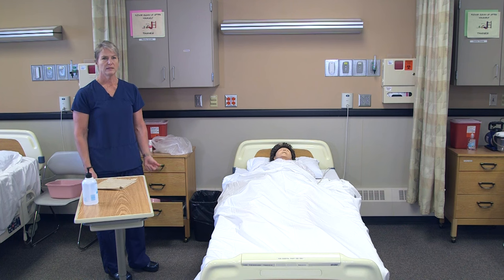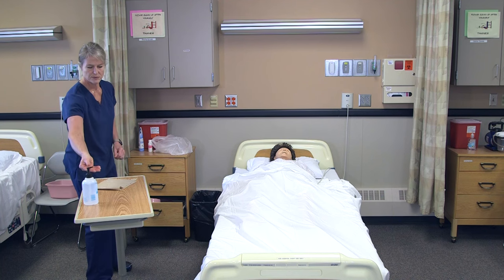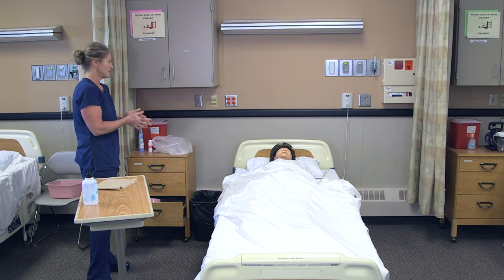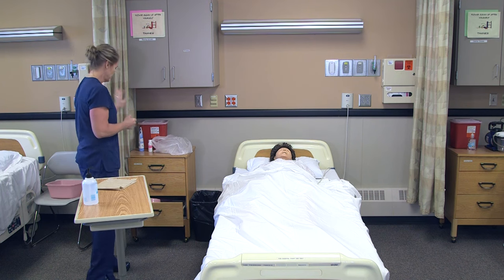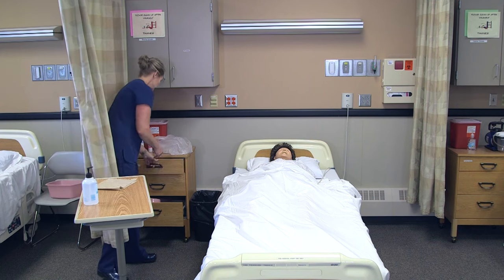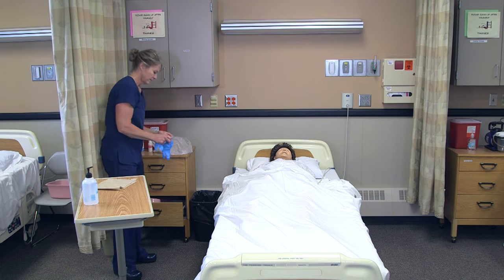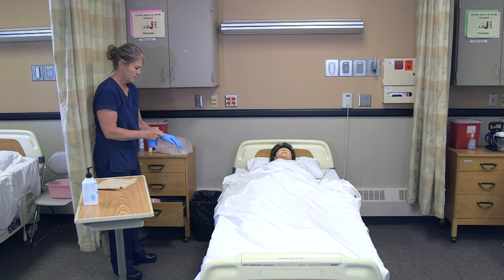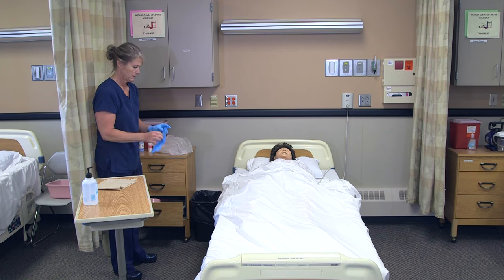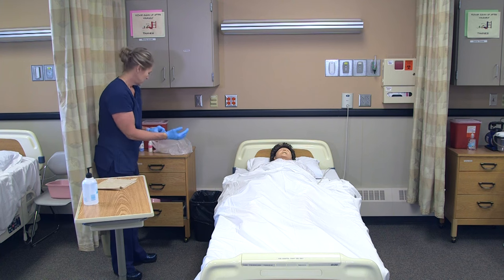When assisting a client with a bedpan, the bedpan should be in their room, but you want to make sure it's there. I'll knock on the door, wash my hands, and greet the client: 'Hi Annie, I'm Myra, I'm here to help you with the bedpan.' I'm going to provide for privacy, put on my gloves, and typically the bedpan is kept in a plastic bag in the nightstand.